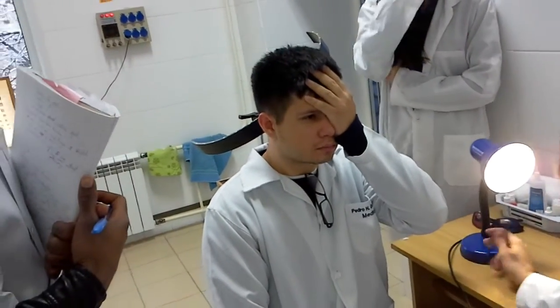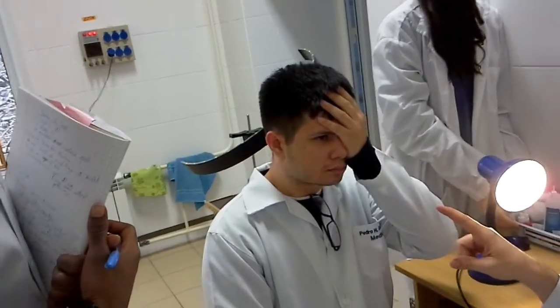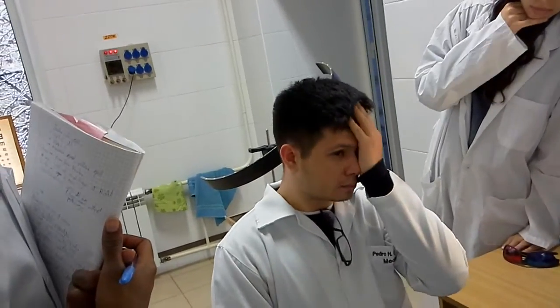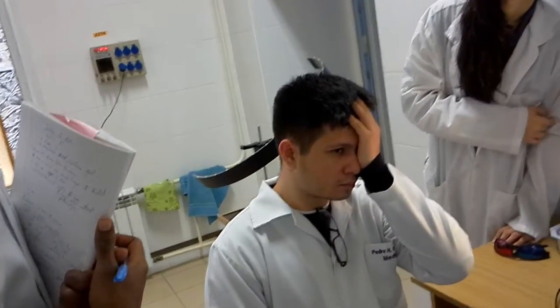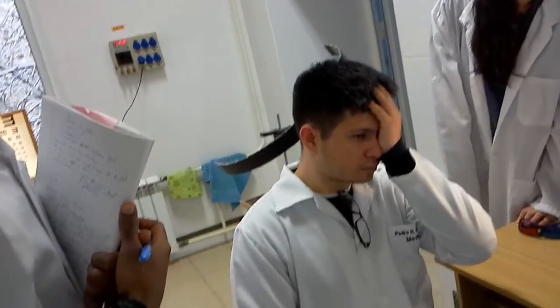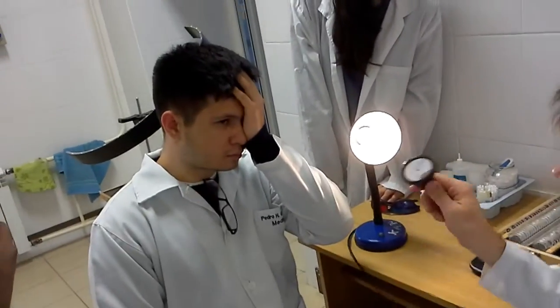Position the lamp opposite the doctor. There must be no light from the main source of light on the surface of the patient's eyes. Because if you put the lamp in this position and begin to show the light from a small ophthalmoscope, the patient will answer left, left, left, because of course this light is stronger. So you should exclude such a situation. Position of the lamp opposite the doctor.